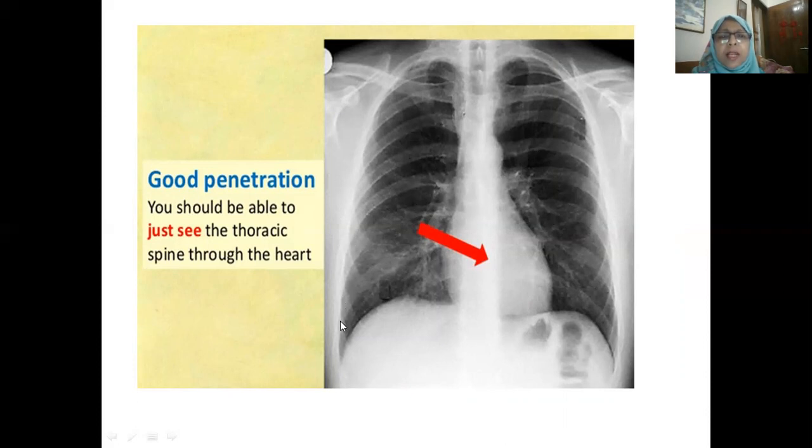Lots of things will come from your X-ray chest. So this is a big portion, a big subject, a big chapter regarding the X-ray chest. I have only discussed the X-ray chest of a child with bronchiolitis. Thank you all.